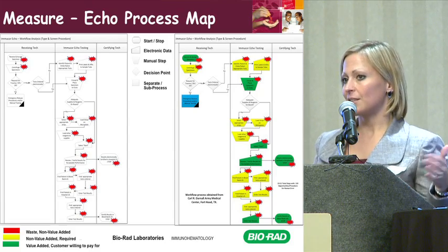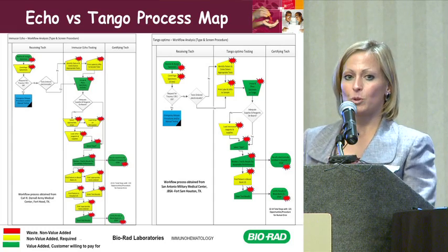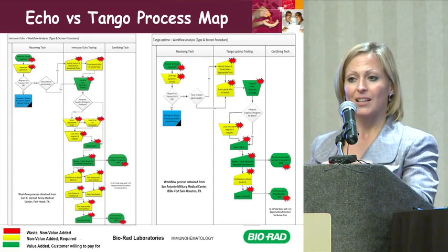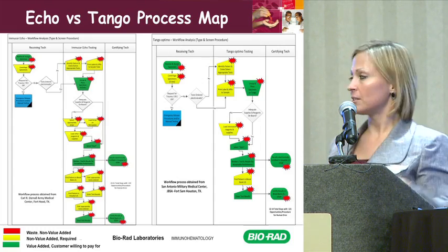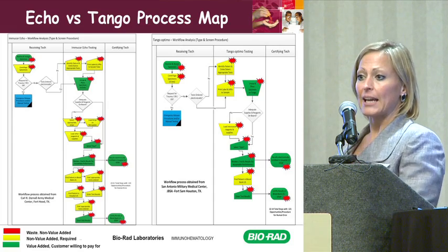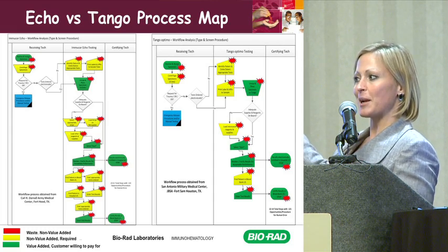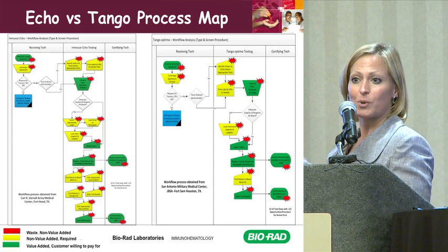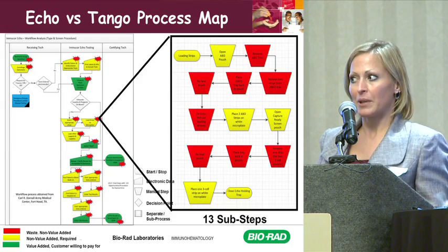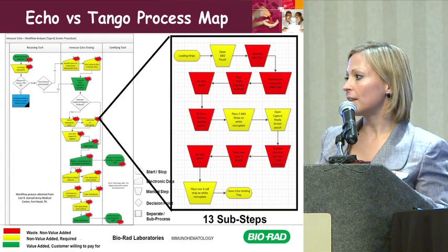These process maps, I didn't take to the level of detail that you really need to take them to for every little thing that's done, because you wouldn't be able to see it. So pretty much for presentation purposes, and to keep the five separate methodologies consistent, I did an intermediate level of detail. So if I look at this closer, for example, if I'm going to load the strips on the echo, each specimen that comes in, this is called a top-down process map. I've taken one step of the process, and there's a sub-process underneath it. Okay, so as I broke that down, well, now I have red blocks. How could that be?